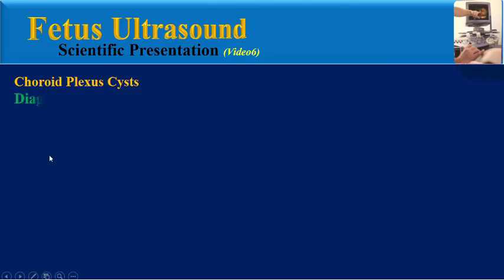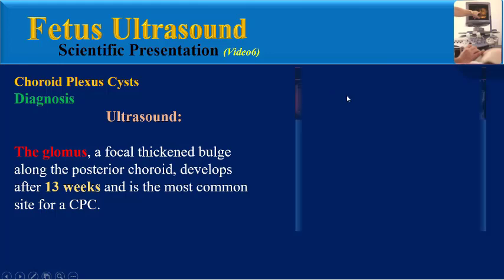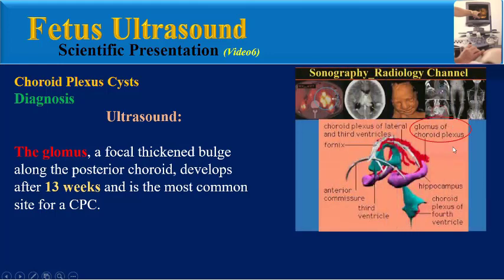For diagnosis, the most important modality is fetus ultrasound. The glomus is a focal thickened bulge along the posterior choroid that develops after 13 weeks and is the most common site for choroid plexus cysts. In this image we can see the lateral ventricles, 3rd ventricle, 4th ventricle, choroid plexus in lateral ventricles, 3rd and 4th ventricles, fornix, anterior commissure, and hippocampi.